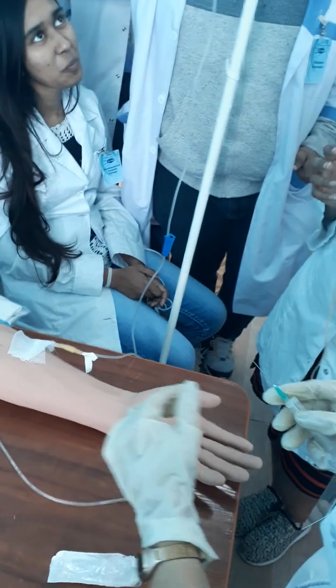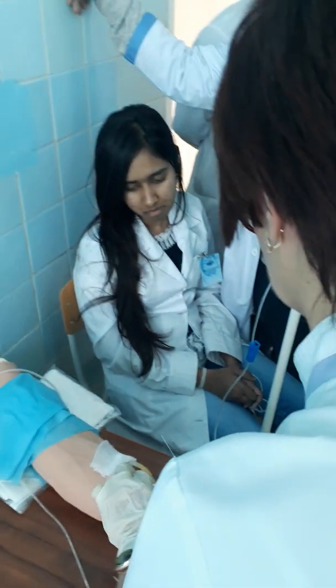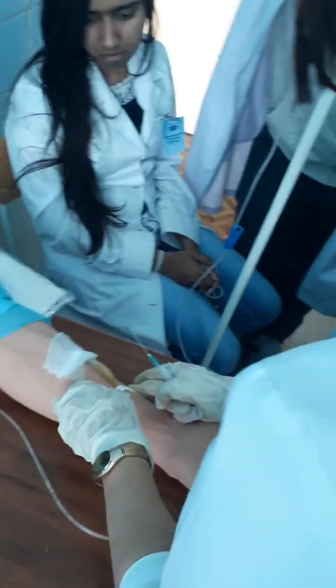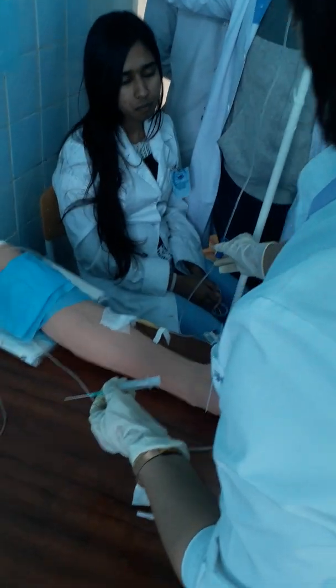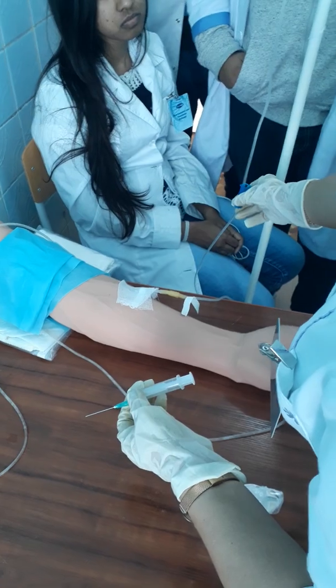Remove your clamp and you see the solution continue. Remove your hand, sorry. You see that the solution continues to flow, continues to administer as before, as needed for you. Or you can close it, administer the solution, and after that open it again. It's not a mistake, it's just convenient for you.